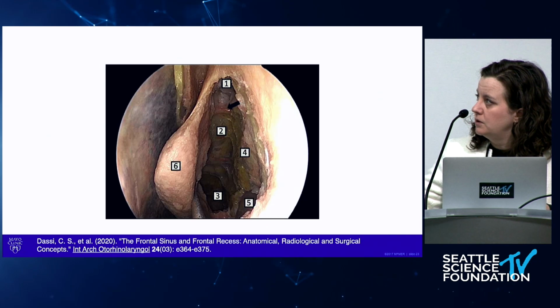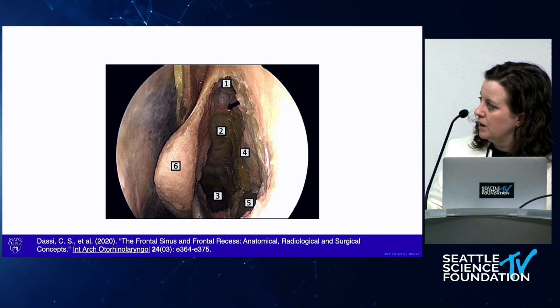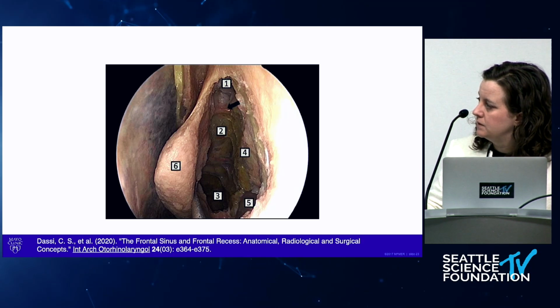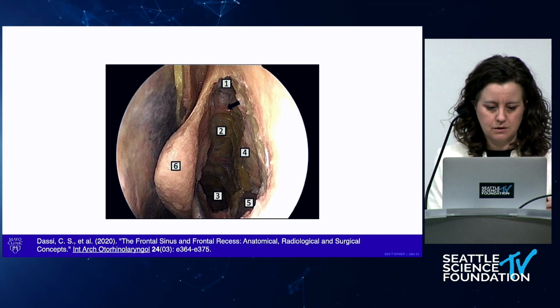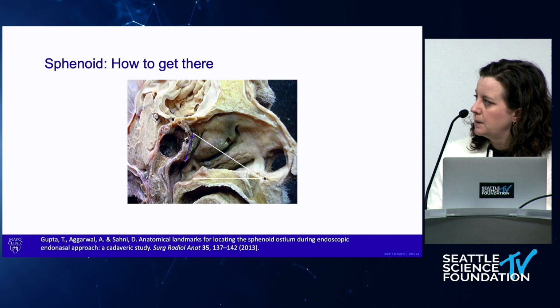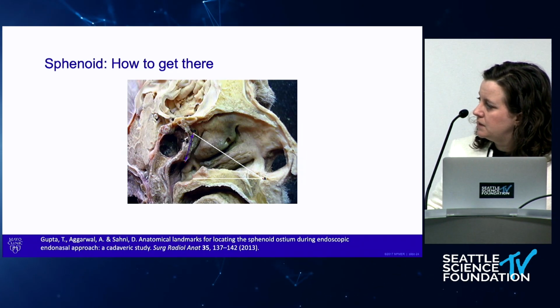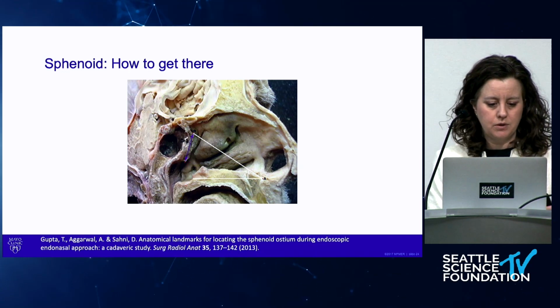So this would be beautiful. This is ideally what we want, and hopefully we will get there, where our lamina is completely clean, our basal lamella is taken down so we can see the posterior ethmoids, and we've got this clean box here. So getting to the sphenoid, we know it's about 7 centimeters back, 30-degree angle, 1.5 centimeters from the top of the choana.